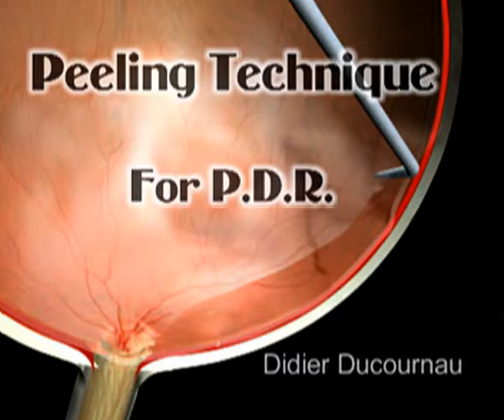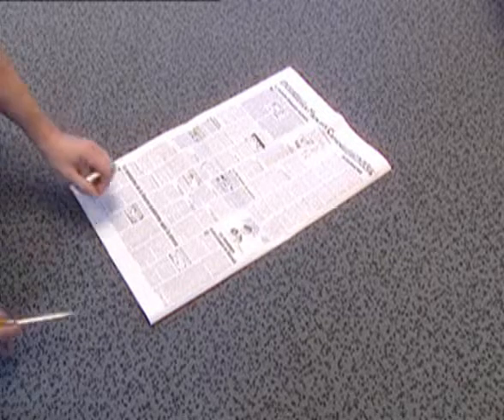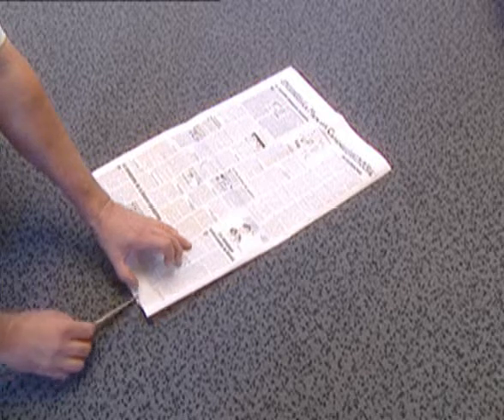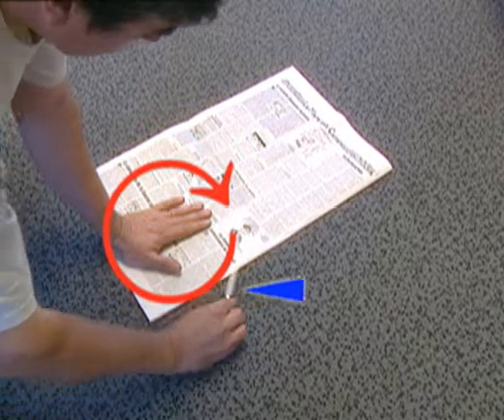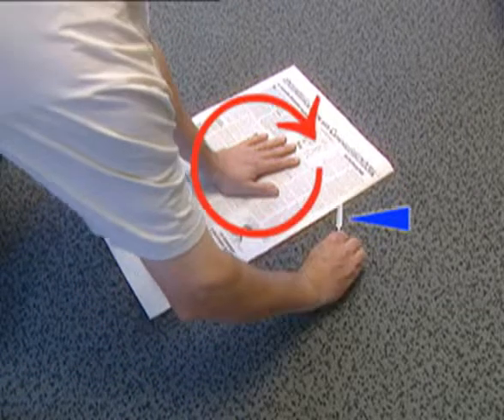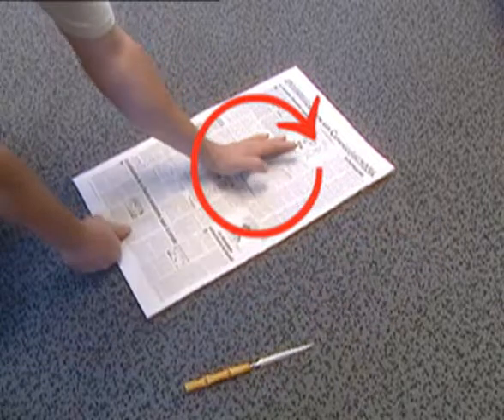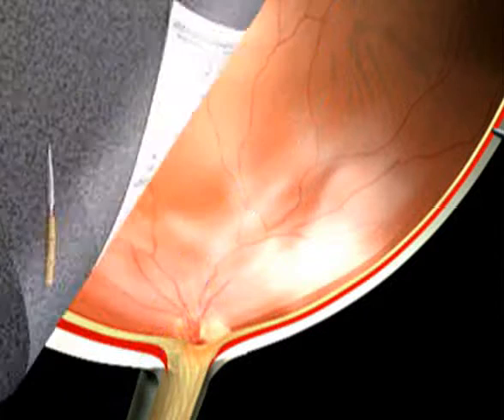The technique I use for membrane peeling in P.D.R. takes inspiration from everyday life. What are we doing when we want to separate two sheets? We fix the sheets with the left hand in order to allow the right one to induce an equal tension to these two sheets and to cut in between without tearing any of them.